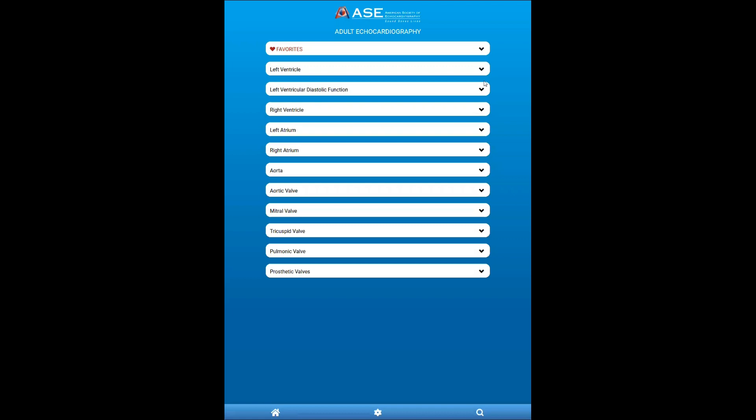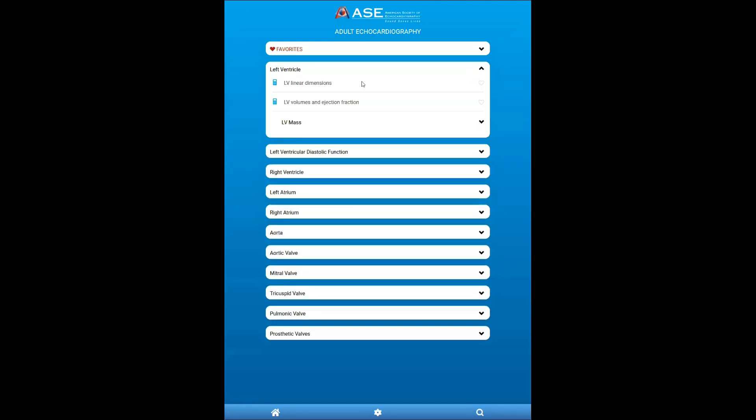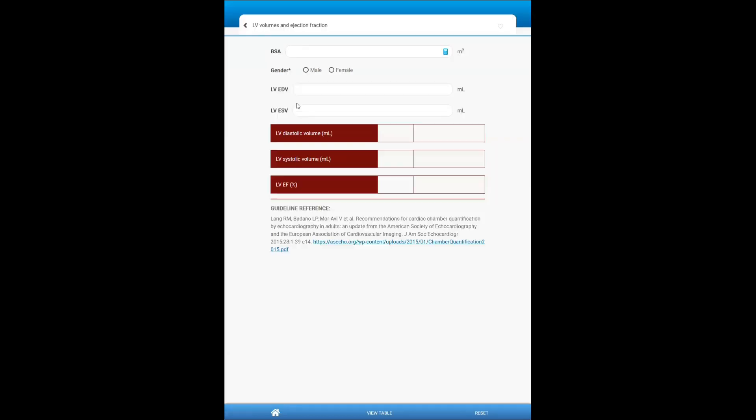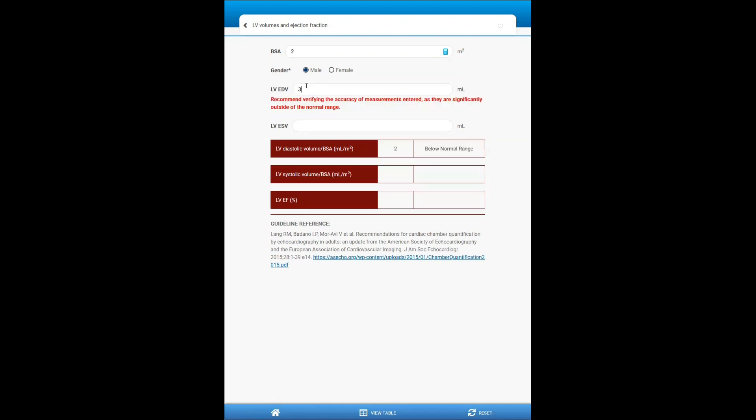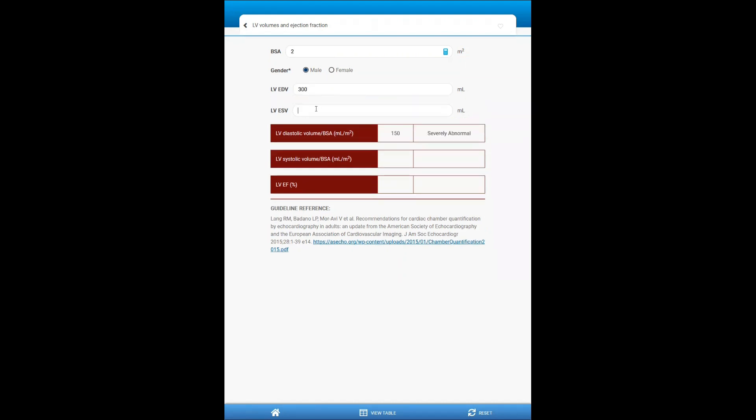There are a little more complex calculators. For example, if I want to look at LV volumes and ejection fractions, so notice a calculator icon. And I can enter some parameters, such as the body's surface area, the gender, end diastolic volume, and end systolic volume.